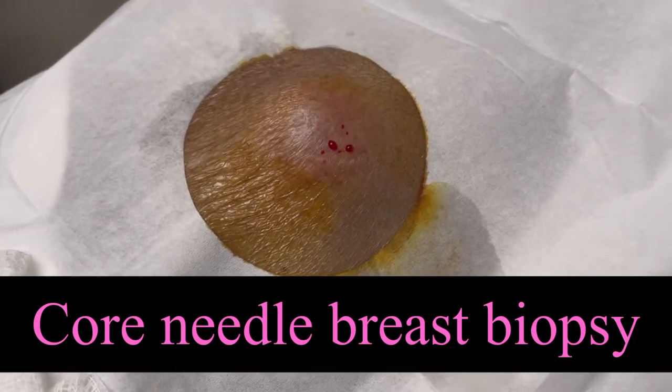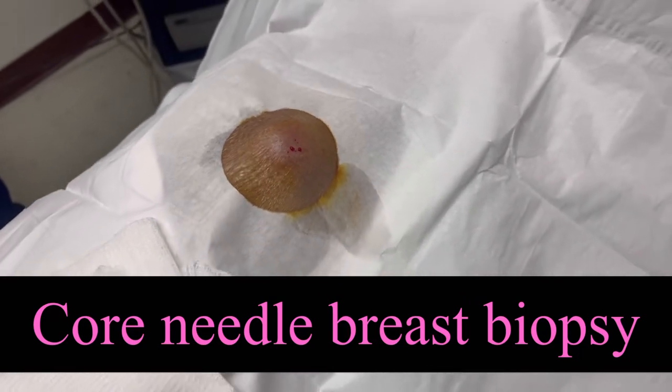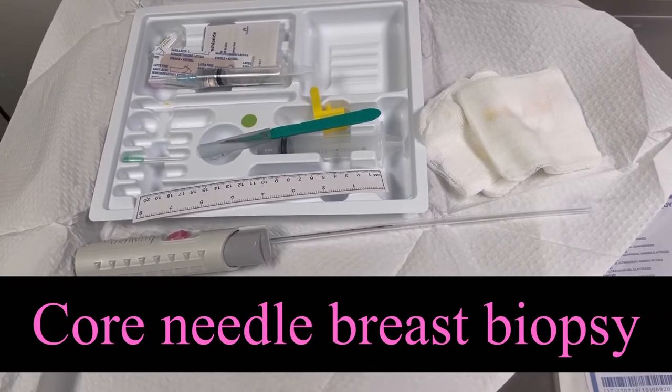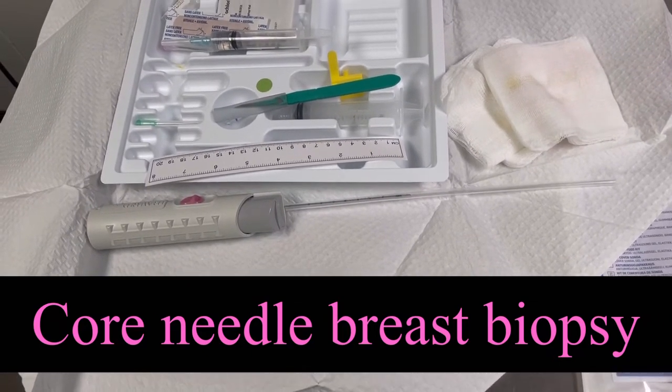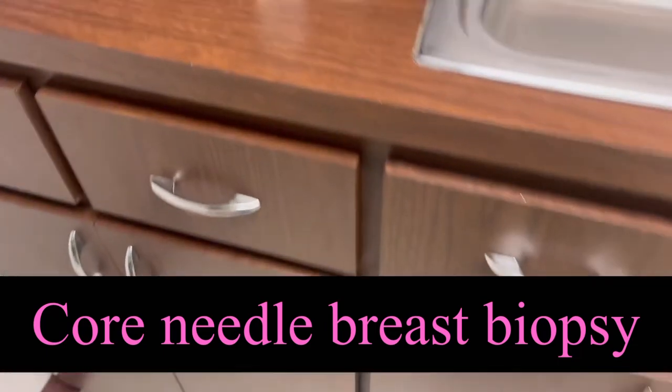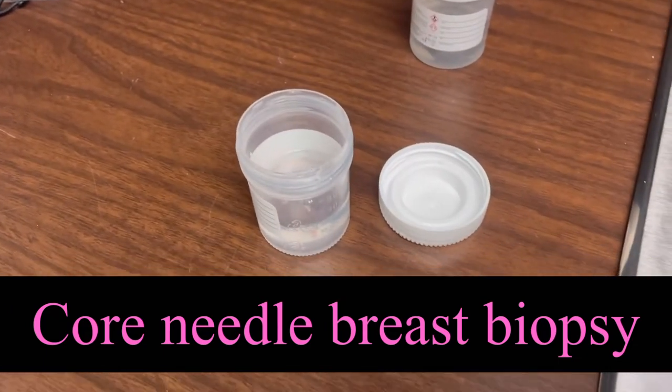This small spot is the small incision for the core needle biopsy. And this is the kit for the core needle biopsy — 16 gauge needle. After this, sending for the final pathology.